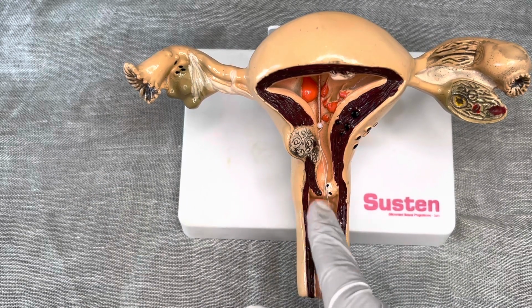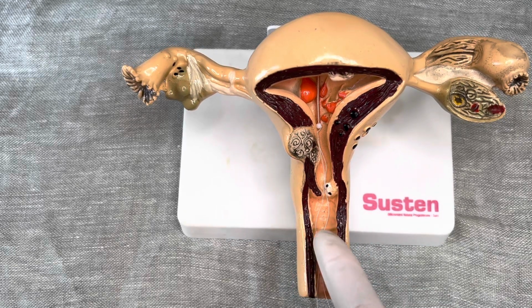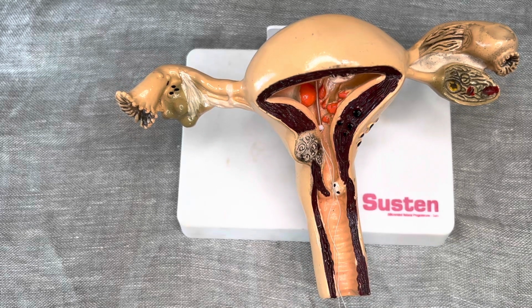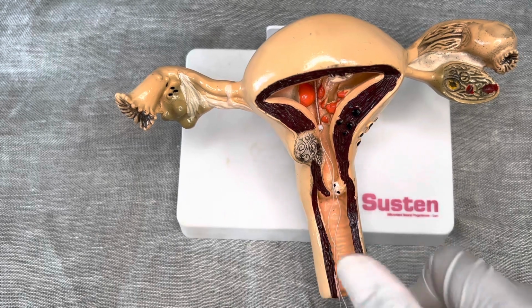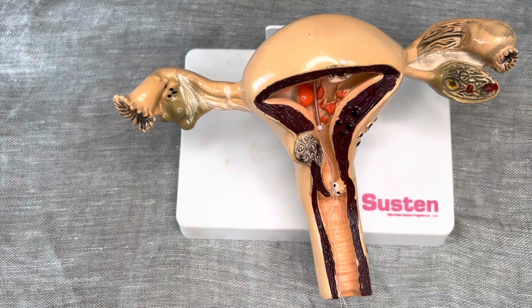You just leave a little bit near the cervix, and then the rest that will be remaining, you try to tuck it in under the posterior fornix, and basically that's it. And now you remove your tenaculum, you remove your speculum, and you tell the patient that the procedure is done.